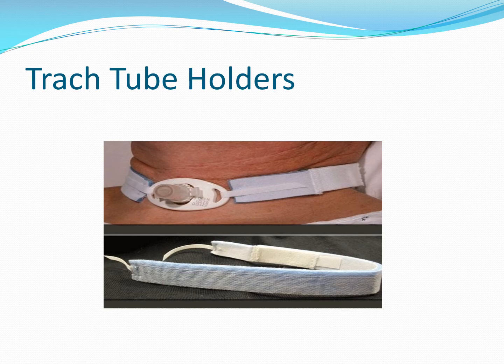Suture removal can vary anywhere from about 2 to about 7 days, and there's a whole lot of reasons for that, but this ENT physician doesn't want to leave that twill tape in place too long for fear that it can result in skin breakdown. So at the end of day 2, we're replacing that. We're taking out the flange sutures, not the stay sutures, and then doing all of our trach care, cleaning it up.